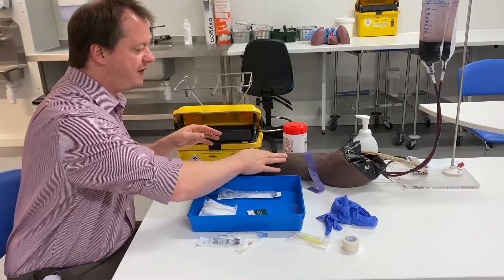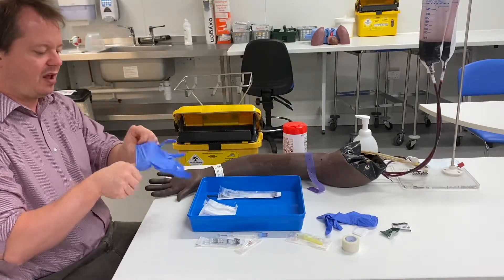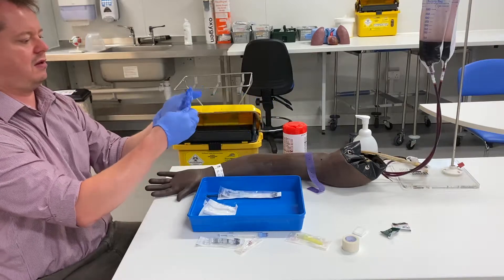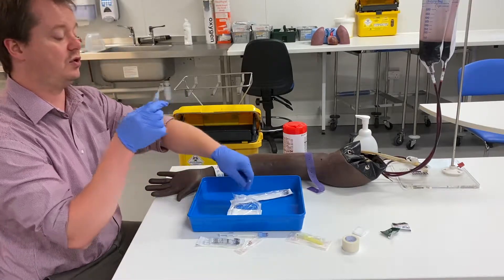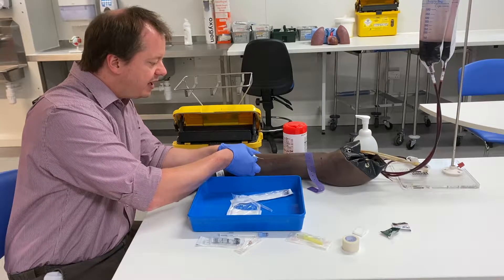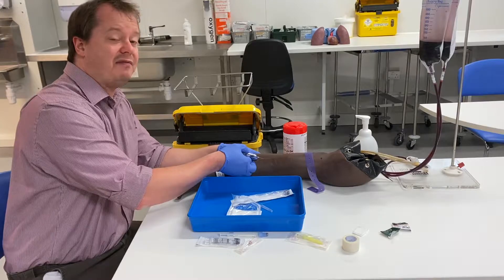If I'm going to do this blood gas, I'll find my vein, give it a good clean like I would do normally, and really importantly allow it to fully dry before I take the test. Then put your gloves on. Take your blood gas syringe, make sure that your bevel is up, then do your skin traction and hold it like you held your needle and holder for a blood test — with your finger underneath and your thumb on top. Then just very carefully insert it into the vein, and what you should find is that the blood will automatically fill into the syringe.